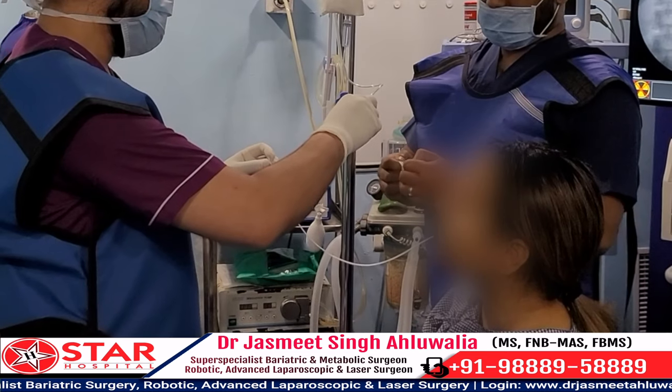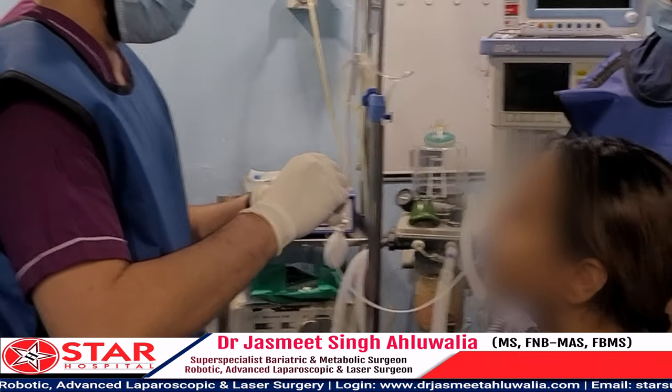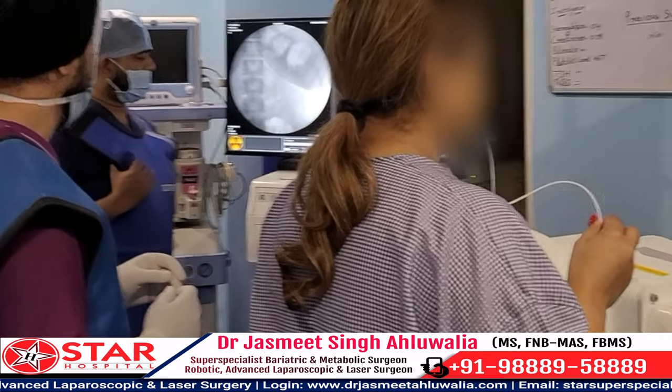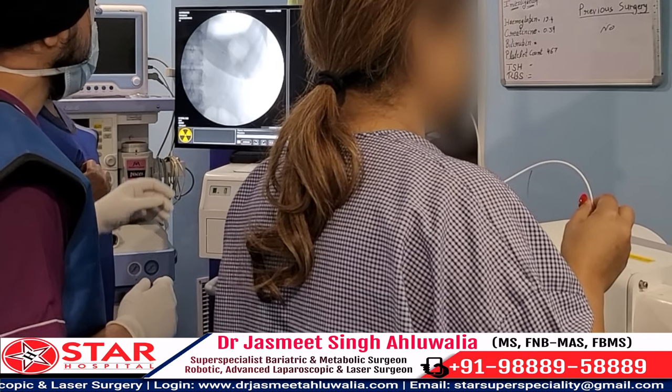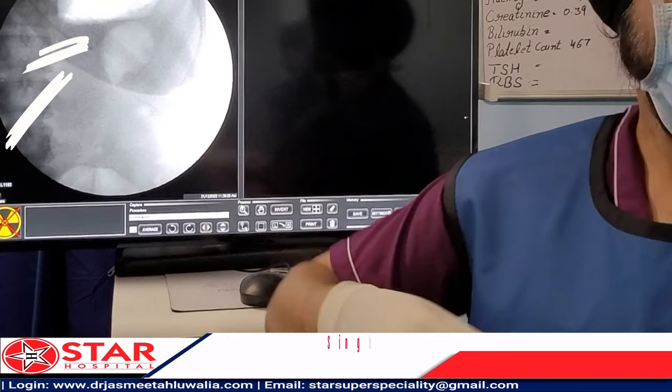The patient has already reached the third mark of the catheter, indicating that the balloon is now ready to be inflated. Just before we inflate the balloon we lock it and then take a check X-ray to make sure that the balloon is inside.